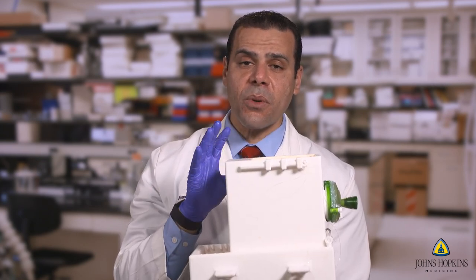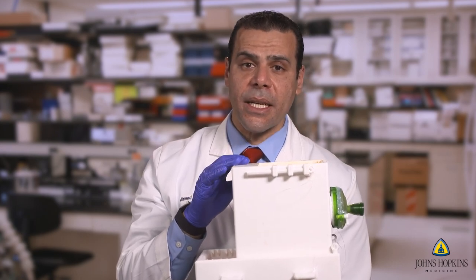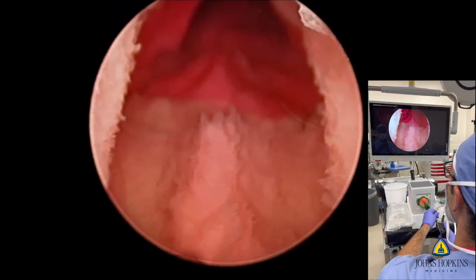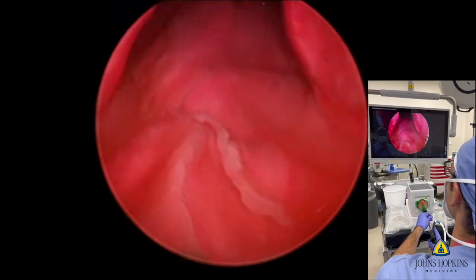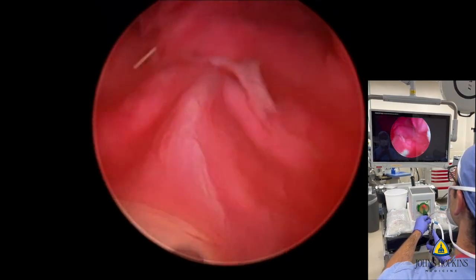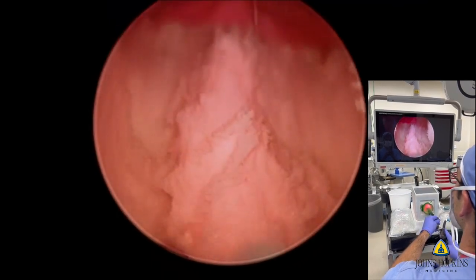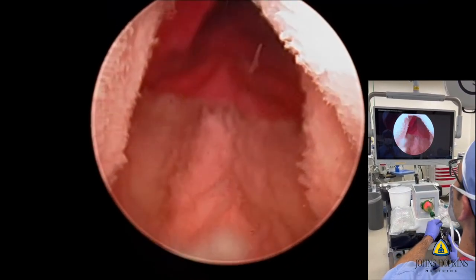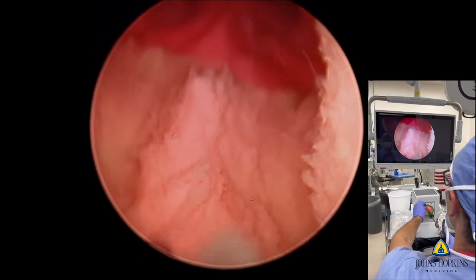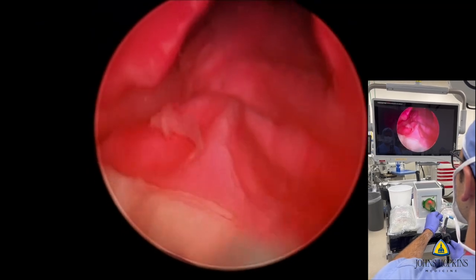As you can see in the video, this is one of the most realistic HOLEP simulations existing right now. With the side-by-side view, the simulation starts by introducing the endoscope. You can see the verumontanum and the external sphincter, and then get a view of the adenoma, which is a 3-lobe prostate at about 85 grams. We've purposely created a color difference — that's the external sphincter that the expert surgeon here is visualizing before starting, then the verumontanum, and then the adenoma.